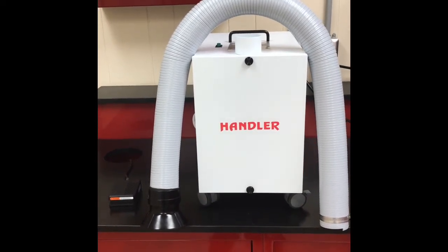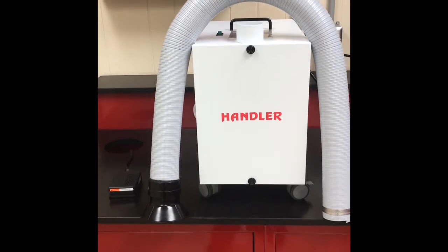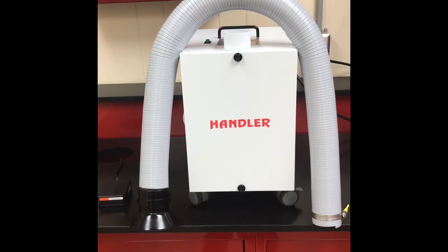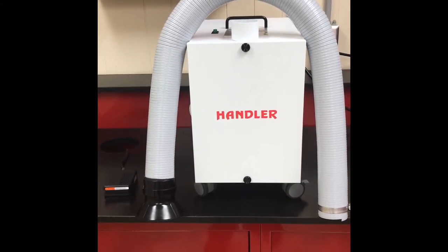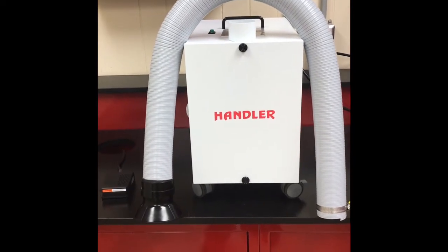This is the Handler 42 ESU Extra Oral Suction Unit that comes complete with an on-off foot control switch, a flexible gray hose that's approximately 42 inches long, and a suction hood that is approximately four and a half inches round in diameter, and of course the suction unit itself.